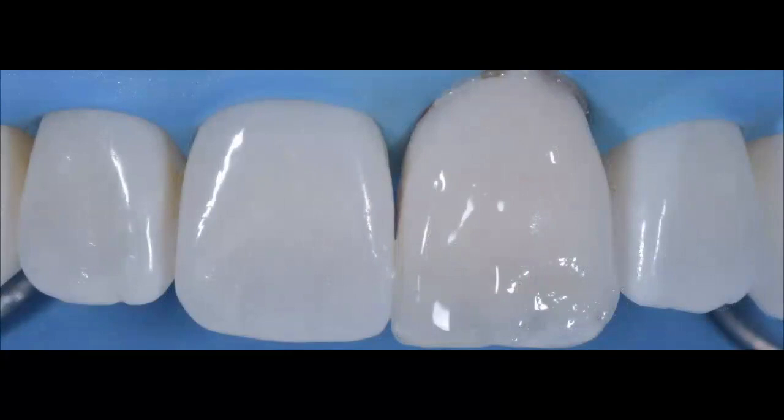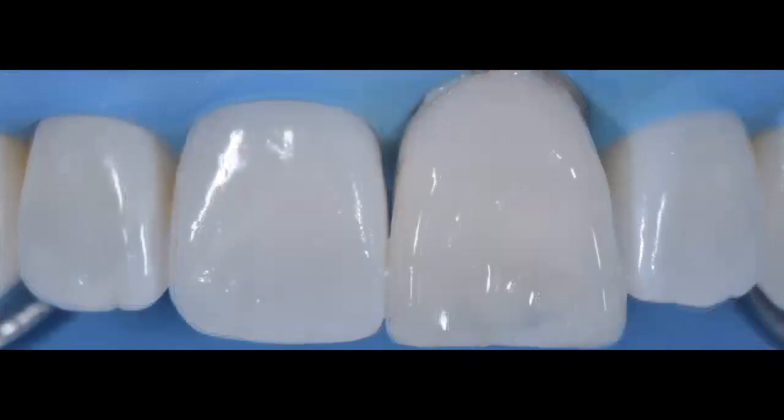Now this bleach translucent, don't forget, you want to have maybe half of a millimeter thickness of this enamel layer. If you use too much, you would end up with a very translucent, very grayish type of tooth. Because we knew that she had a very high value, we wanted to make sure that we had enough OBL dentin shade, very light shade, so that we just have a very thin layer of enamel. And again, half of a millimeter, no more than that. That's what you're looking for.